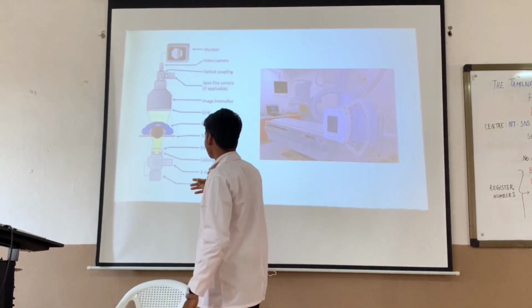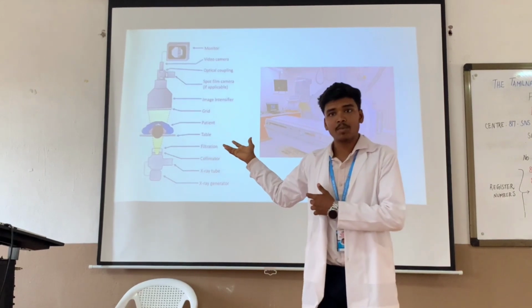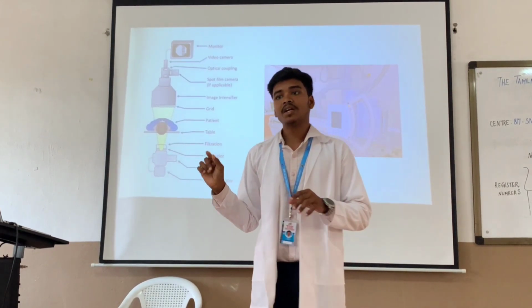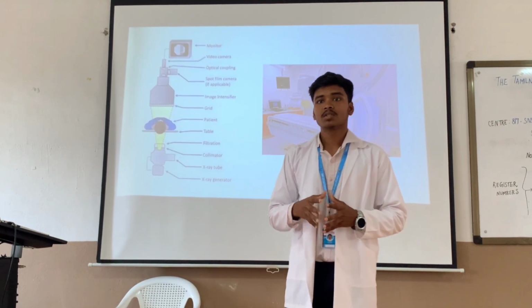That's it. Then the table, where the patient is placed. The table is made up of a radiolucent material called carbon, and it can move front and back, up and down.